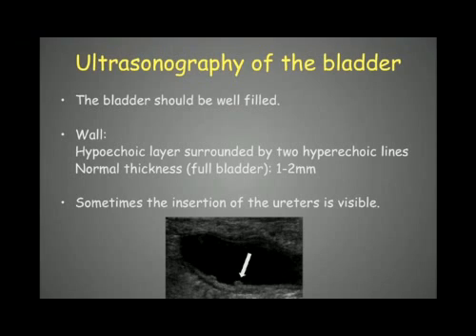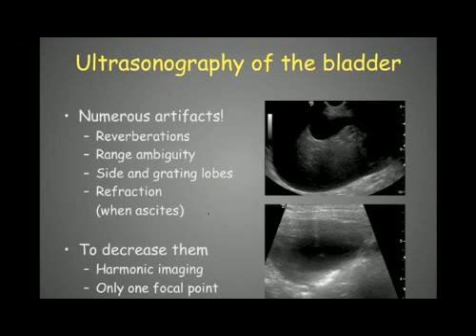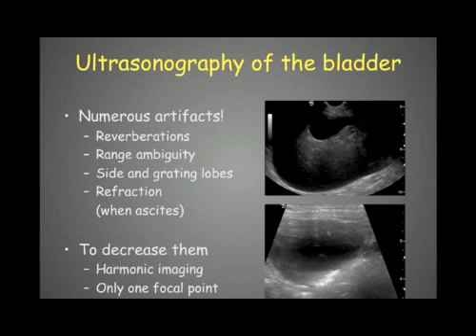Sometimes we can see the insertions of the ureters into the wall of the bladder, at the level of the dorsal wall at the trigone of the bladder. We have to be careful when interpreting an ultrasonography of the bladder because there are a lot of artifacts created at the level of the bladder. For example, we can see reverberation artifacts due to the reverberation of the ultrasound beam on the abdominal wall and on the ventral wall of the bladder.